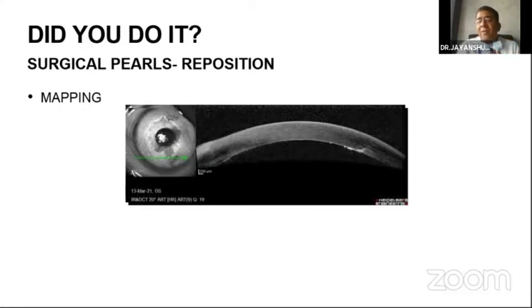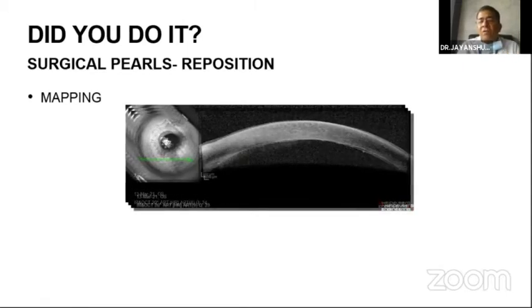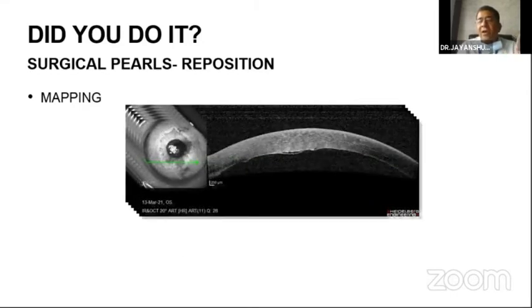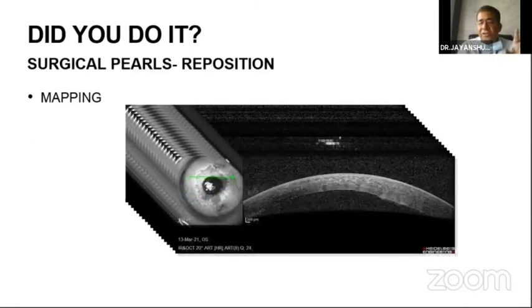And at the same time, in certain sections we can see the wound, whether the detachment is stripping from the wound or is it away from the wound, and things like that. So we get an idea about how far the DM is detached, what is the area of the involvement, where it is located, and accordingly we can plan our interventional procedures.